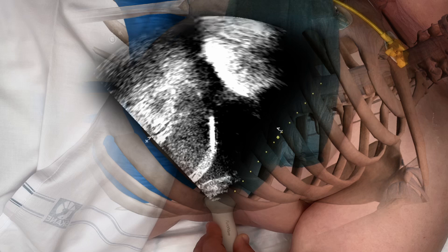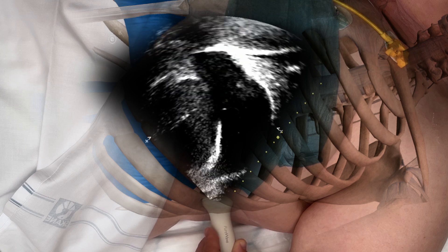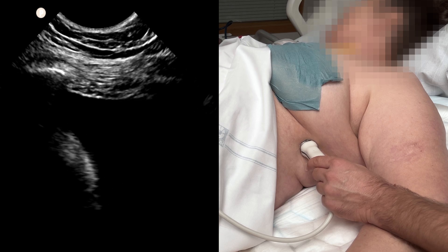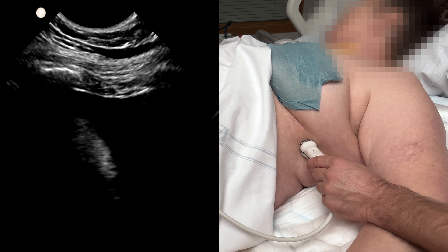Let's briefly flip the ultrasound picture and superimpose it over the patient to further clarify the orientation. Looking between the ribs, you see the diaphragm, the fluid, and the lung. After choosing the puncture site, switch to the microconvex probe and set depth, gain, and focus, so you have everything in order for when you're scrubbed up.